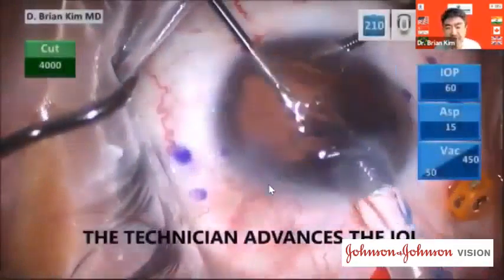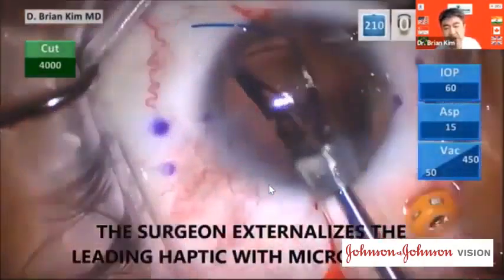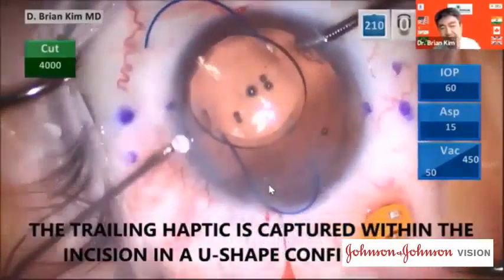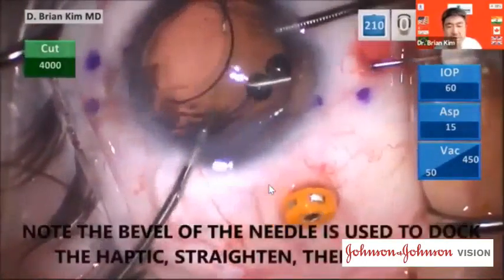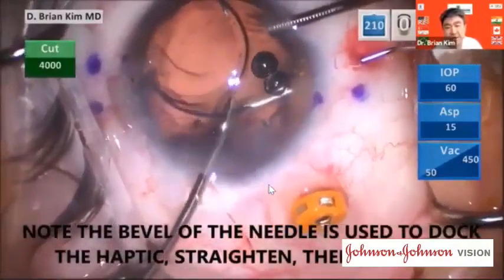So this is a modification. Your technician advances the IOL, and the surgeon externalizes the leading haptic with microforceps, the trailing haptic swept to the right, and then the trailing haptic is captured within the incision in a U-shaped configuration. The apex of the U is the ideal place to grasp the haptic. Note the bevel of the needle is used to dock the haptic, straighten, and then advance.